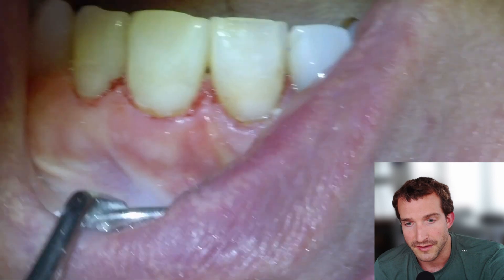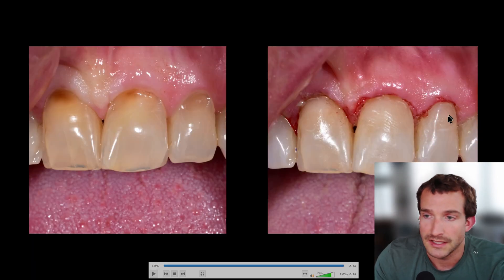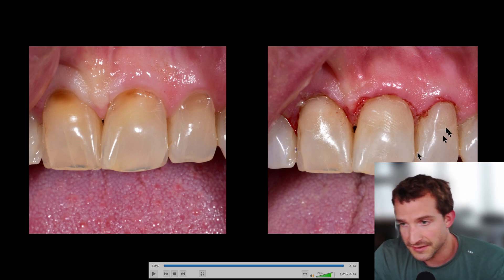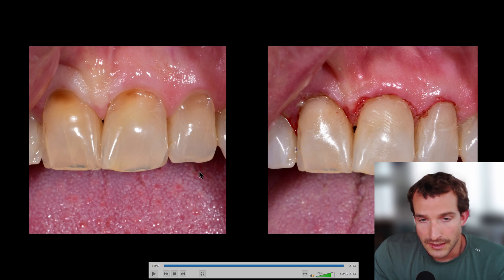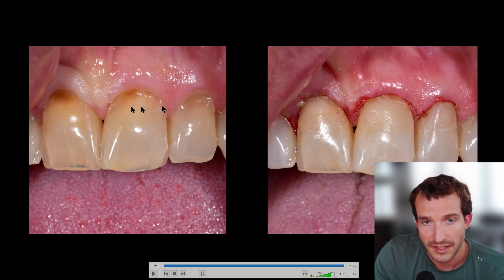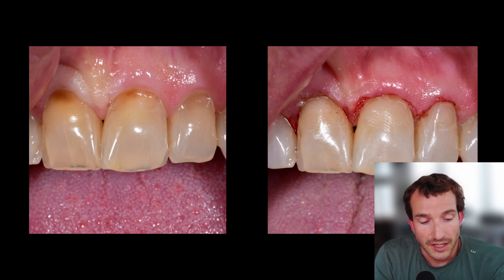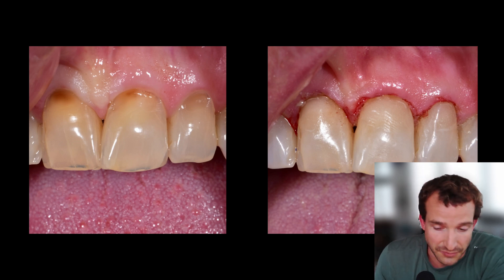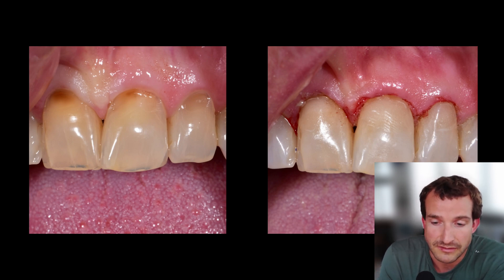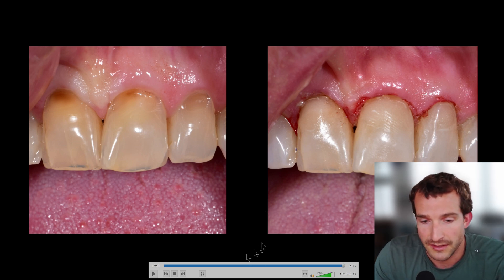The point about the before and after is that it looks whiter than it actually does in real life, because the teeth dehydrate slightly. Once a couple of weeks have passed and the gums have healed and the teeth have rehydrated, it's going to look a lot more like the original shade, just with the abfraction lesions filled in. I generally don't advise restoring abfractions unless it's for aesthetic or sensitivity reasons — because otherwise it's just not necessary. All right, that's it for that one.